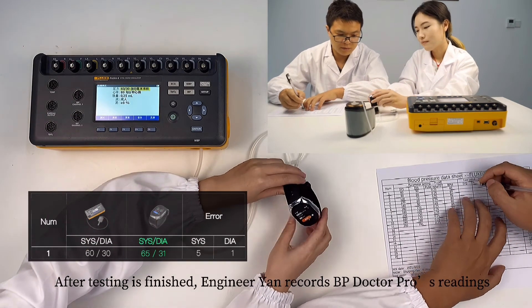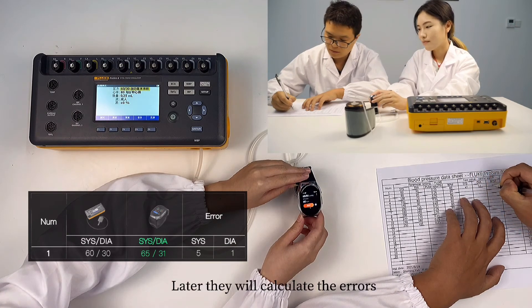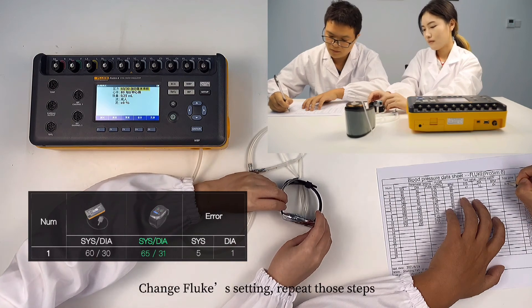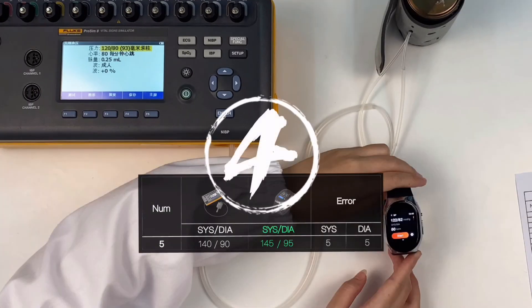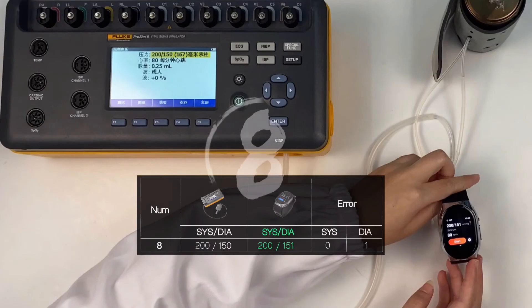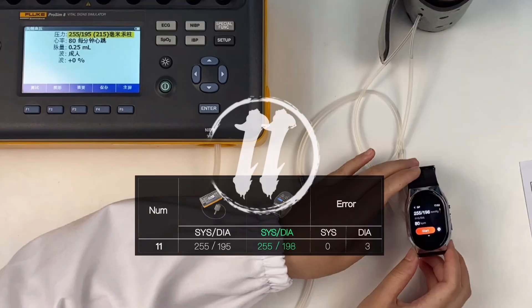After testing is finished, Engineer Yan records BP Doctor Pro's readings. Later they will calculate the errors. Then they change the Fluke settings and repeat those steps to get the remaining results.